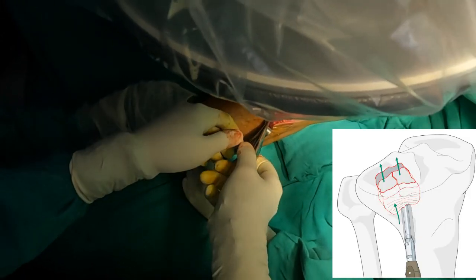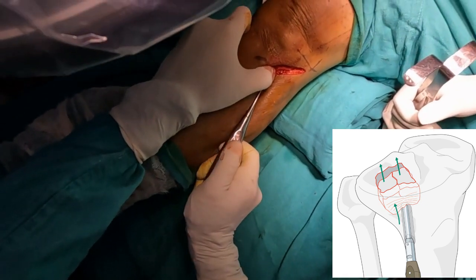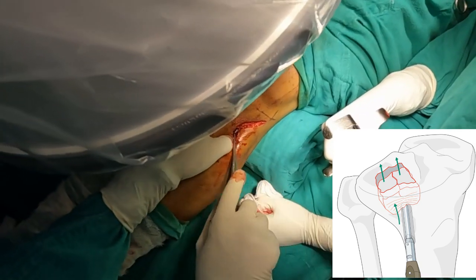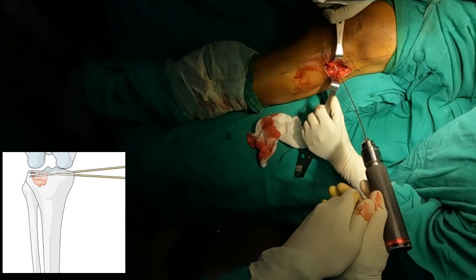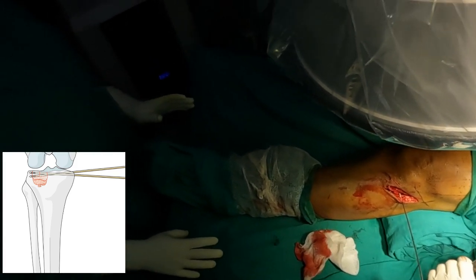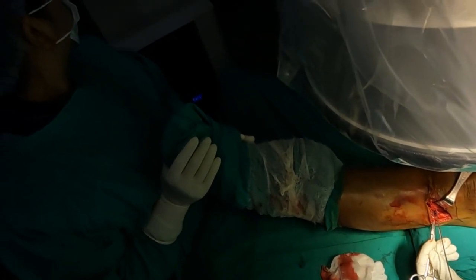A bone tamp is then introduced through the window to gently elevate the depressed articular fragment from below. We continuously monitor and confirm the accurate anatomical reduction under C-arm fluoroscopy. Once satisfactory reduction is achieved, a provisional guide wire is passed subchondrally. This holds the elevated articular surface in place and guides our drill bit for cannulated cancellous screw placement.